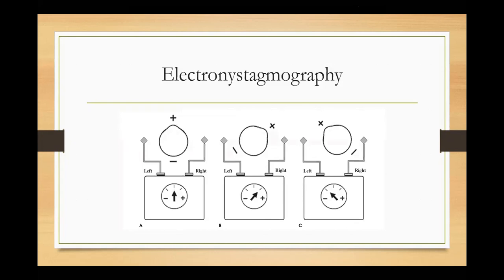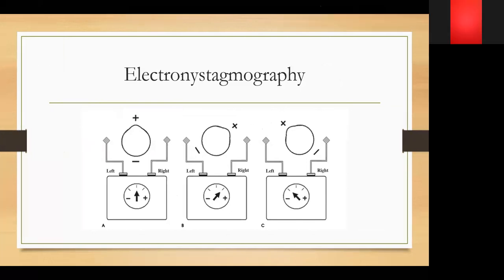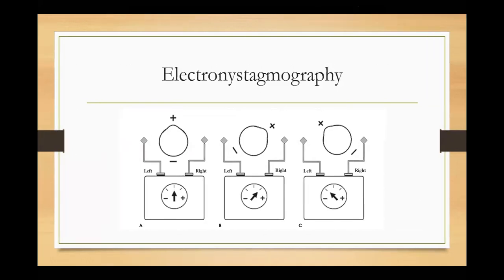When we do an ABR, usually we keep our negative and positive electrodes based on what? When there is a firing, your cochlea will have more potential when compared to the other side, which means you have negative close to cochlea and positive close to forehead. Compared to the positive, the cochlea has more potential. That's why it is recording as a positive signal.